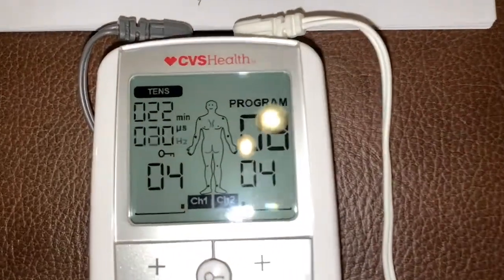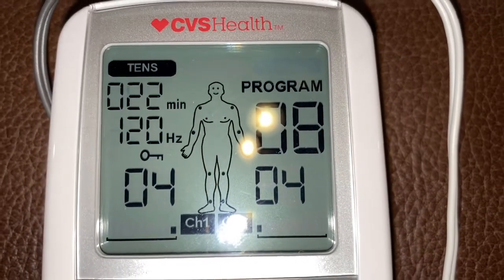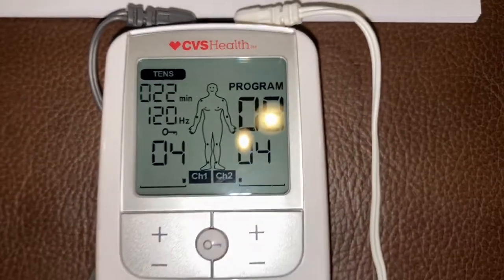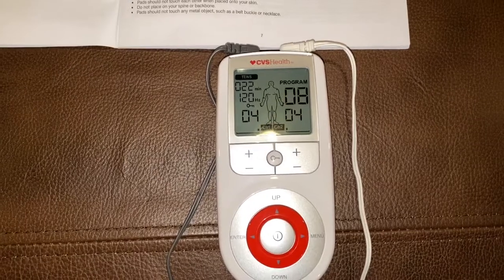You can see here the lock key is on. I was going to get up and move around a little bit — I'm at minute 22 remaining. I did press the lock key so that when I'm up walking around, I won't mess up the buttons.